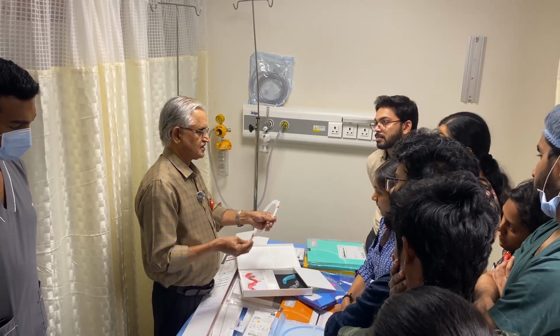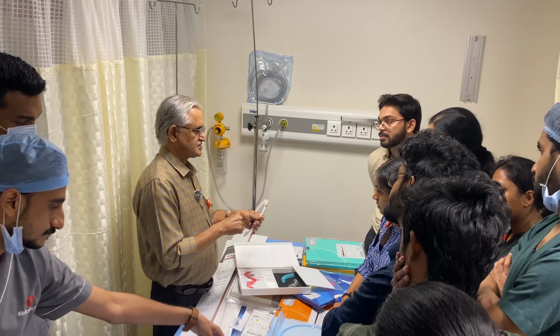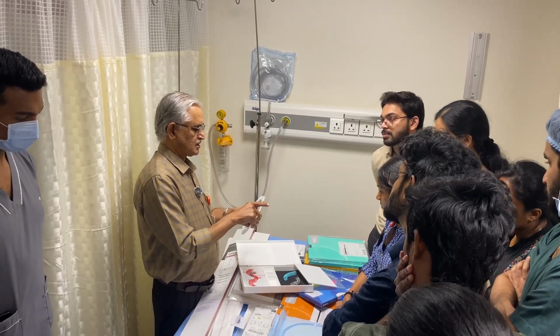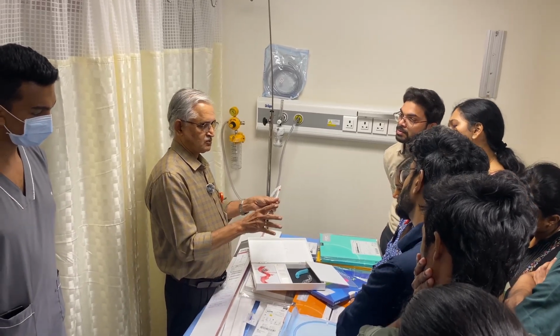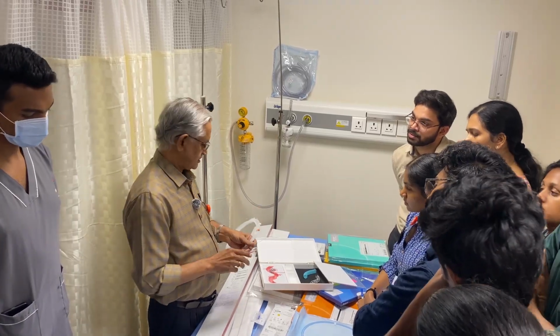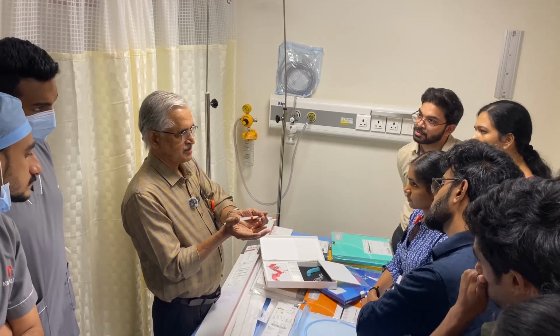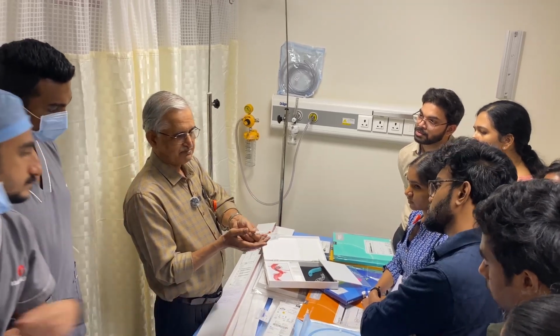All these are used in different proportions to make the coils, and coils are different. The initial coil, the first coil, is generally called a framing coil, which will be soft and form an outer covering to the aneurysm. It will almost take the shape of the aneurysm.